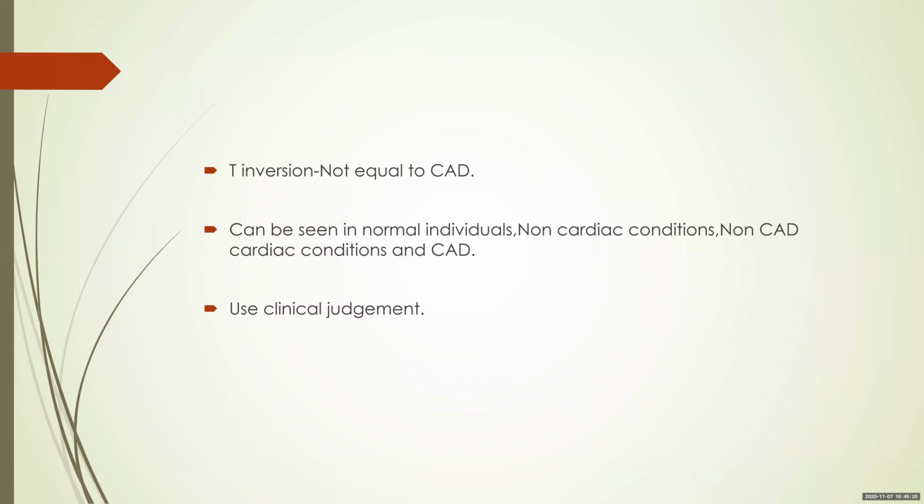T inversion is not equal to CAD. T inversions can be seen in normal individuals, like in hyperventilation and the postprandial state.